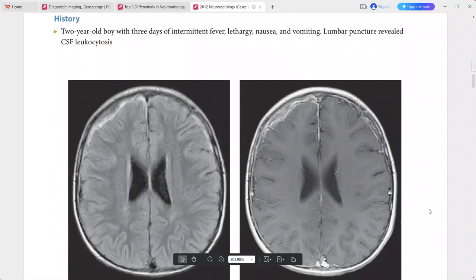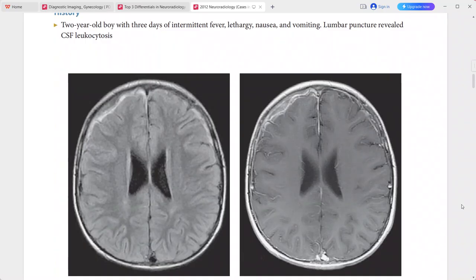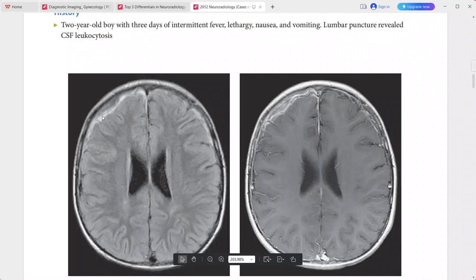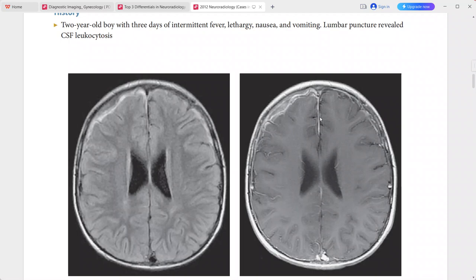Next: a 2-year-old boy with 3 days of intermittent fever, lethargy, nausea, and vomiting; lumbar puncture revealed CSF leukocytosis. FLAIR shows hyperintense signal in the subdural spaces along both frontal lobes, predominantly right. Post-contrast shows a right-sided rim-enhancing subdural collection.